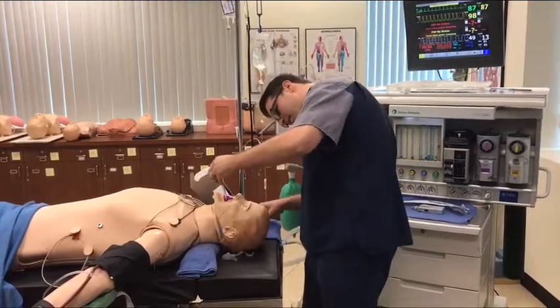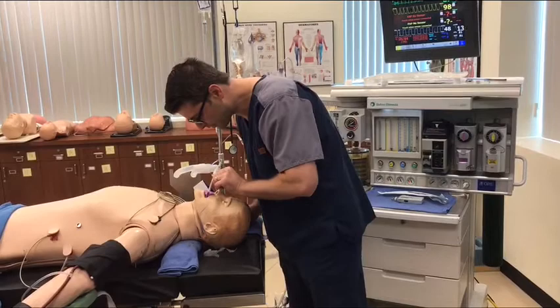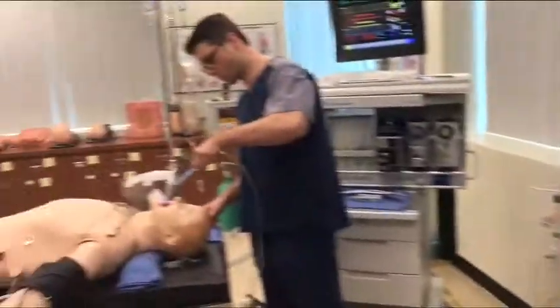The reality is, most of the time they're not going to wake up that violent, especially if they were already asleep. Your younger male patients will typically wake up violent. Your younger females, they're going to cry. So when we think about right before, I would have had that tape off and everything. As soon as I know that he's there, I'm pulling that tube out. Go ahead when you're ready. So, suction.